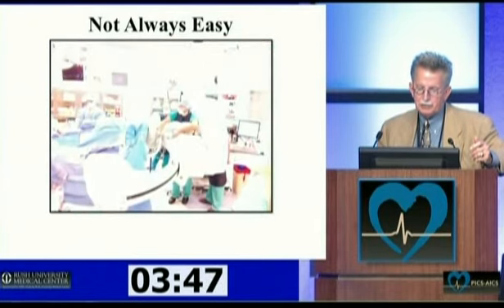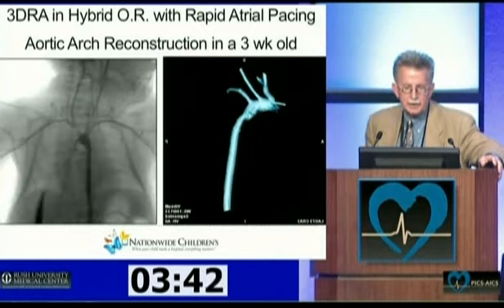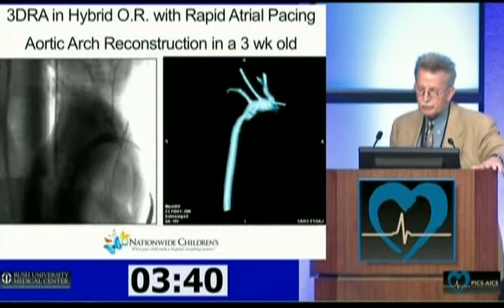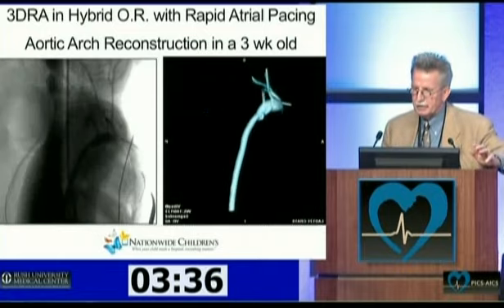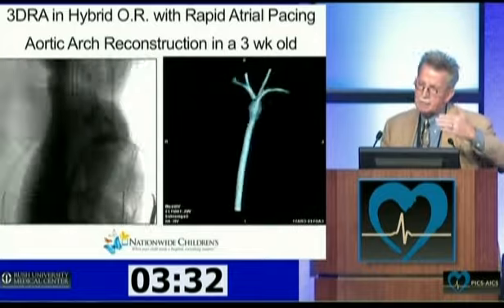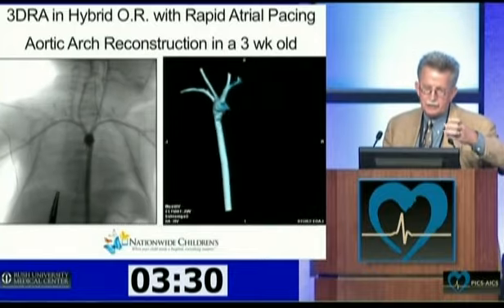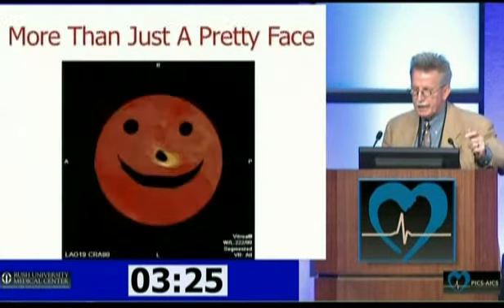But this is just a patient that we did last week. It's a little 3-week-old that just had aortic arch reconstruction. And again, very similar to what Lee showed, you can see lots of different images that will help you make decisions. And also, the same thing that Lee showed you, all of the other things you can see in there, whether it's the trachea and the lungs and everything else, we of course cut that out for this one.